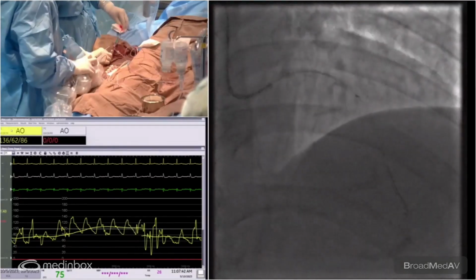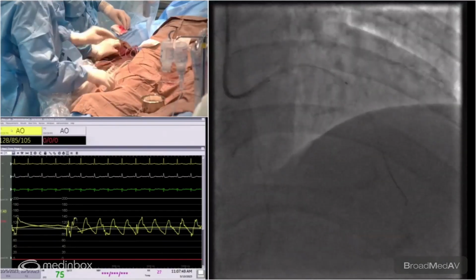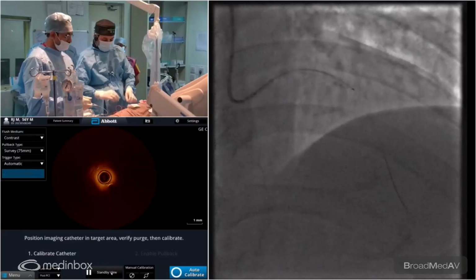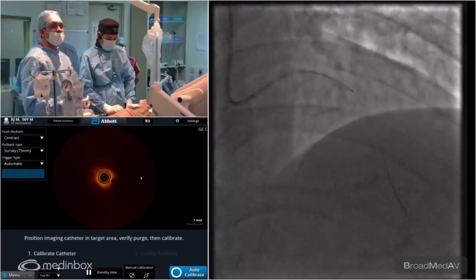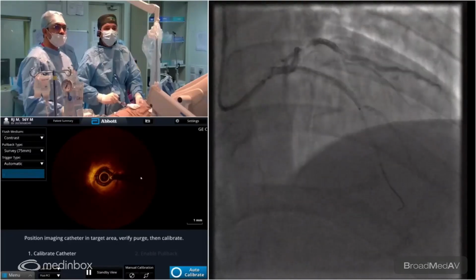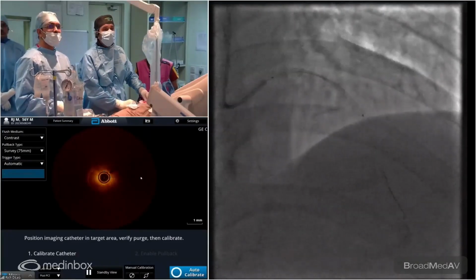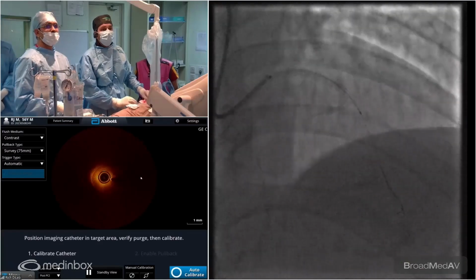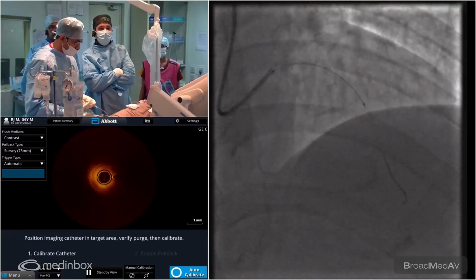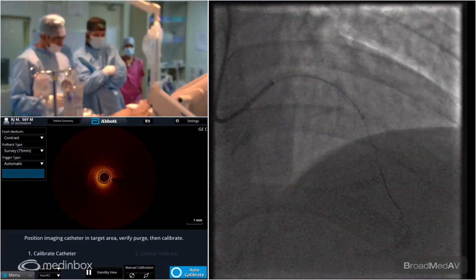Yeah. So let's have a puff to see that the clearance is there. All right. So can you just check the clearance, please, the short left main? Yeah, flush. Clear the OCT. Yeah, one second. Sorry. Okay, that's good. Right, all clear. Okay, that's good. Yeah, now it's clear. Check. Okay. Yeah, I'm done.